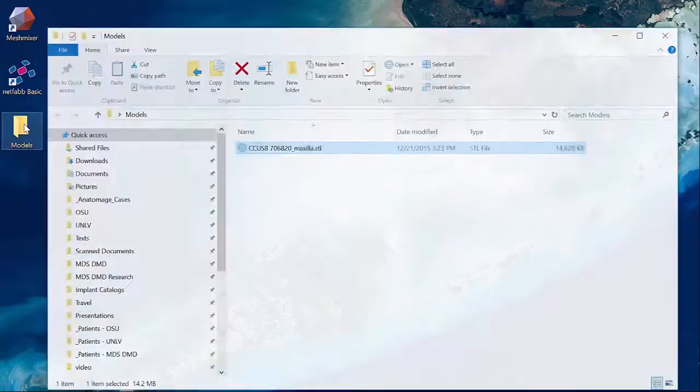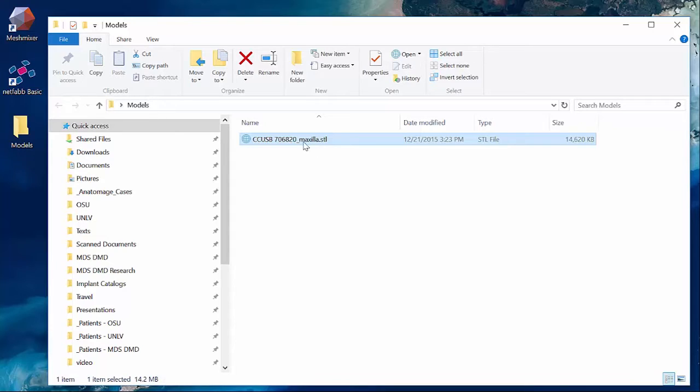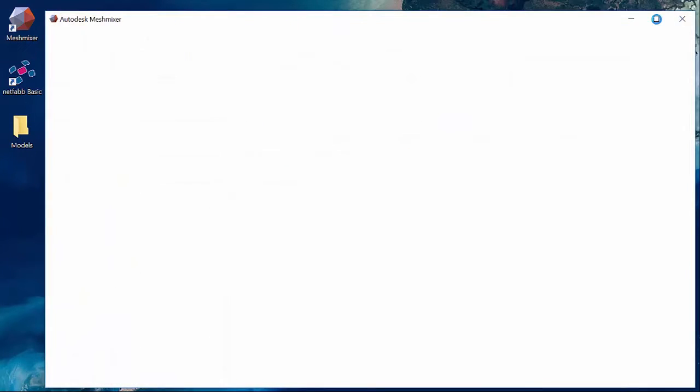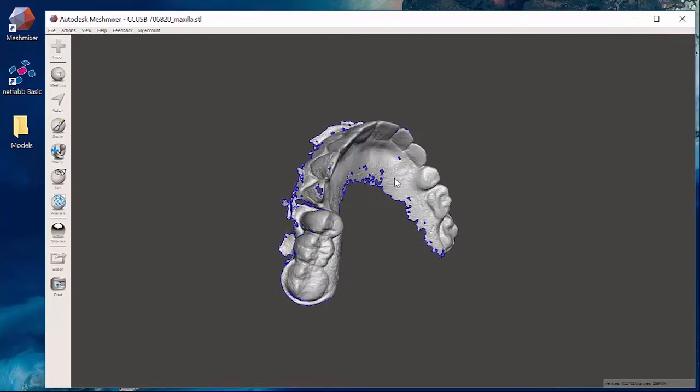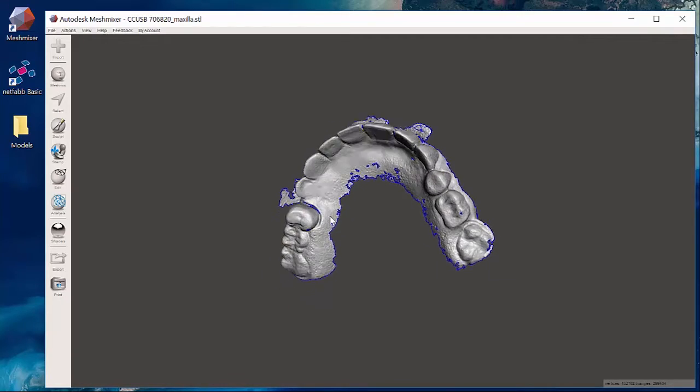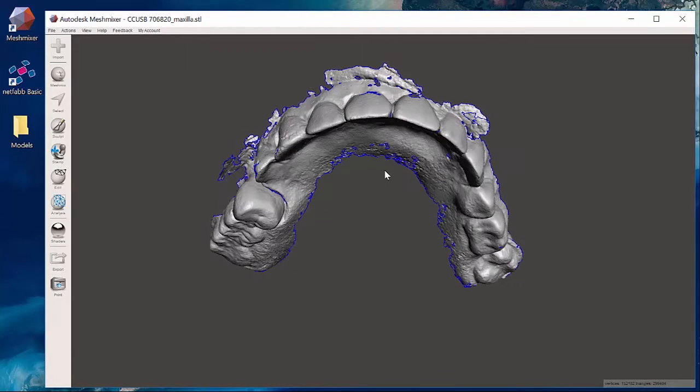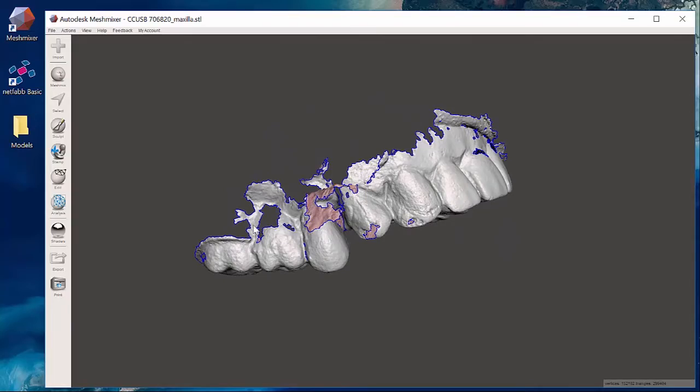I'm going to open my models folder and all I have is her maxilla, at least in this folder, but I did scan her mandible or lower as well. As I bring that into my mesh mixing software, what you're going to see is this STL file is actually an RPD, a removable partial denture.